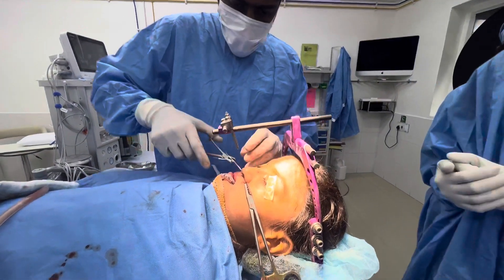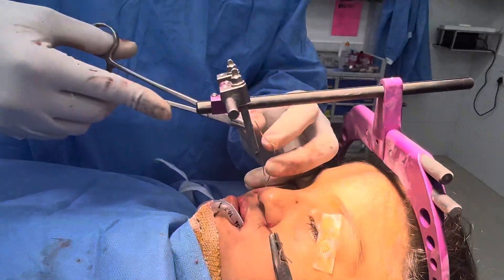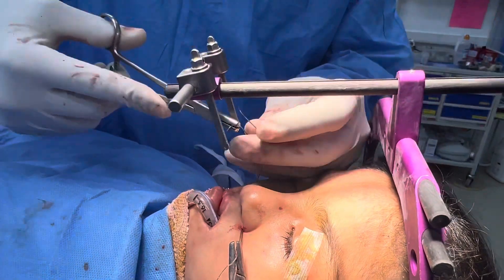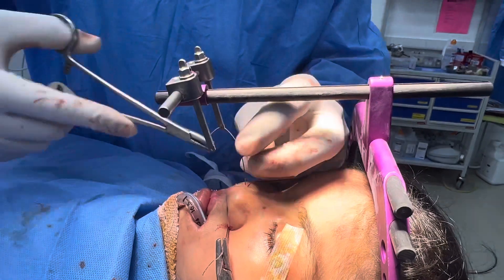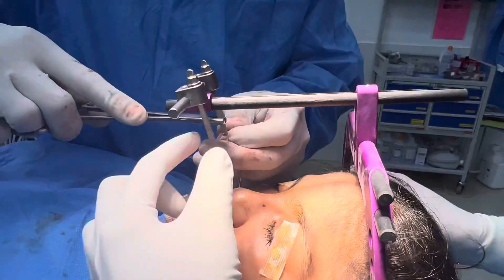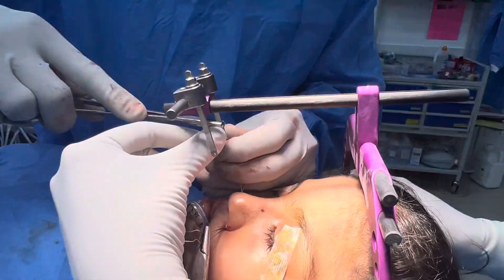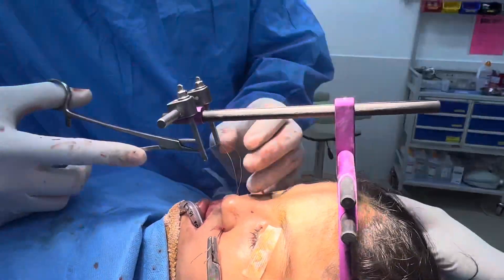You're going to see me put the wire through the slot now — so you can see I'm engaging the wire. I wasn't sure if two wires would come through, but I'll try. And it comes through, okay.